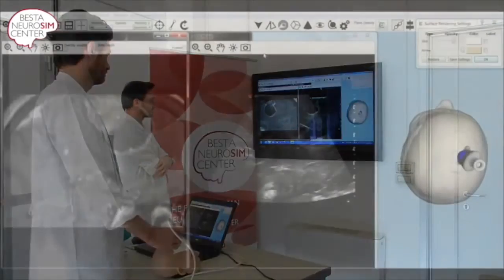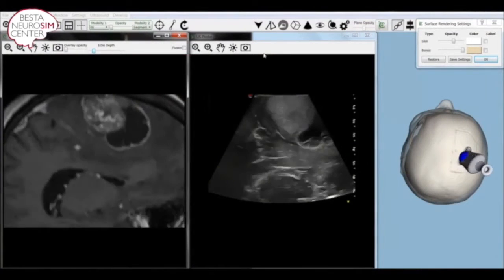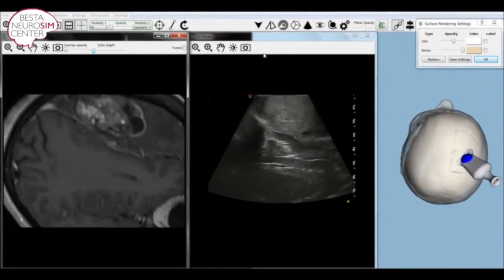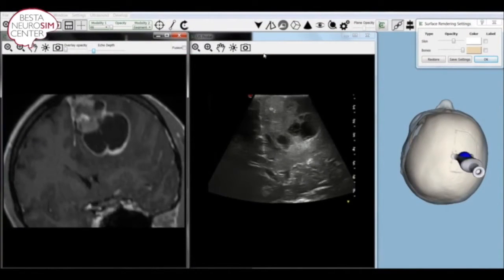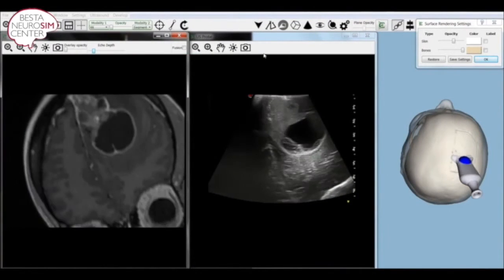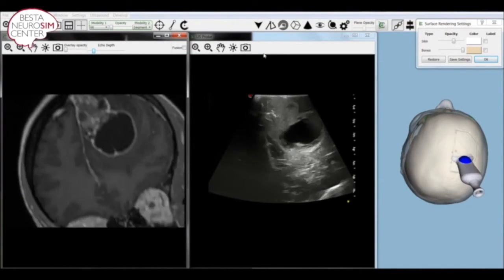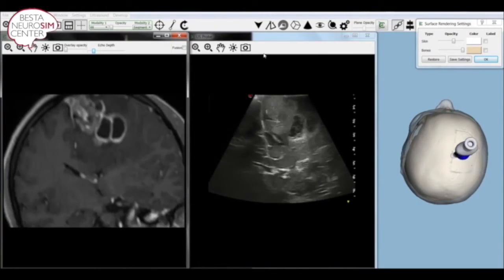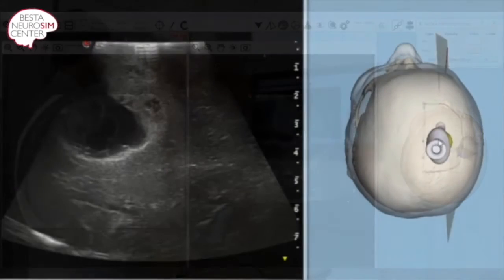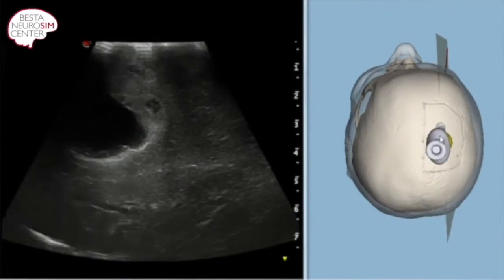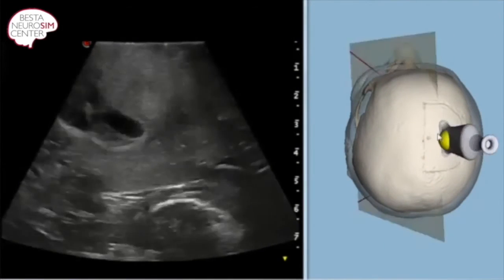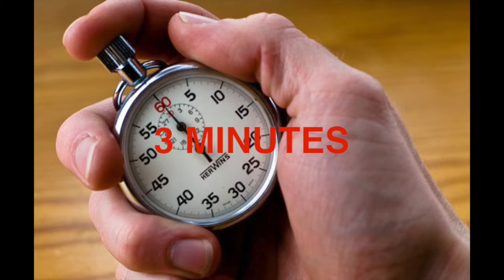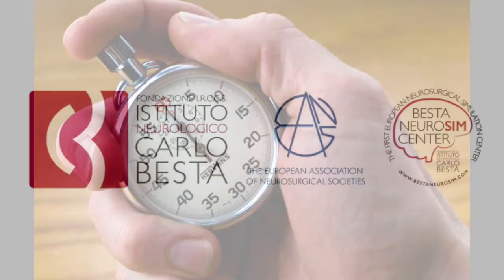Then, you will be shown the same brain structure in B-mode US together with the co-registered co-planar preoperative MRI set of images. You will repeat the same task identifying the same structures in B-mode US only. You have three minutes to complete this task.